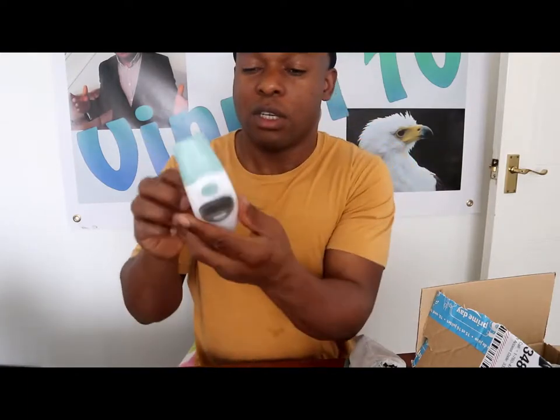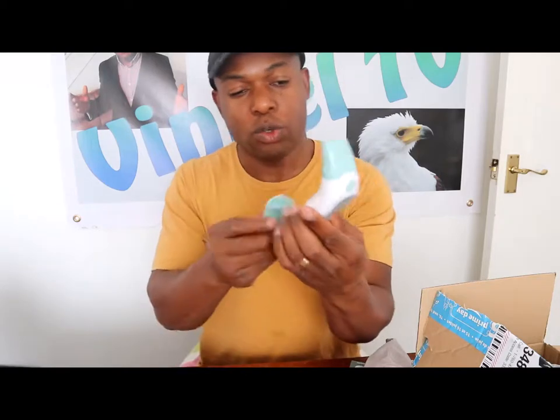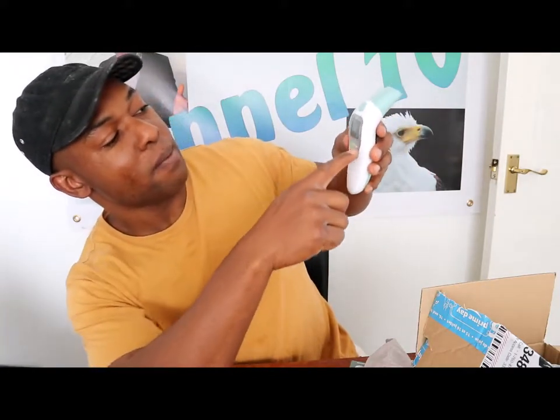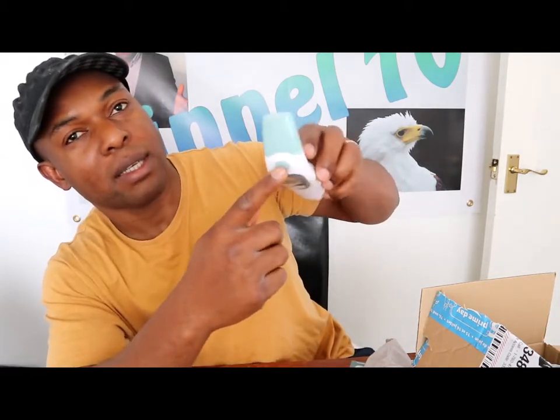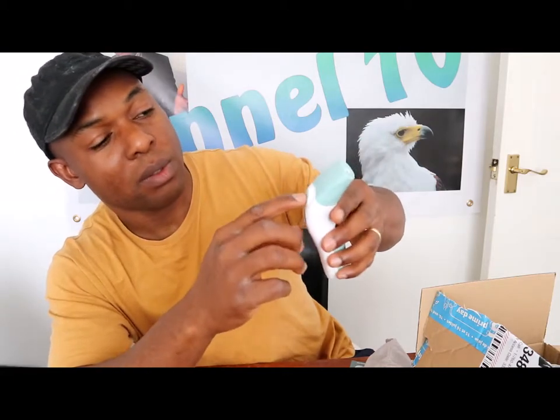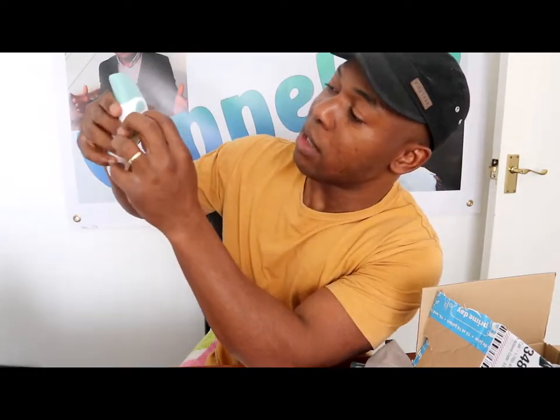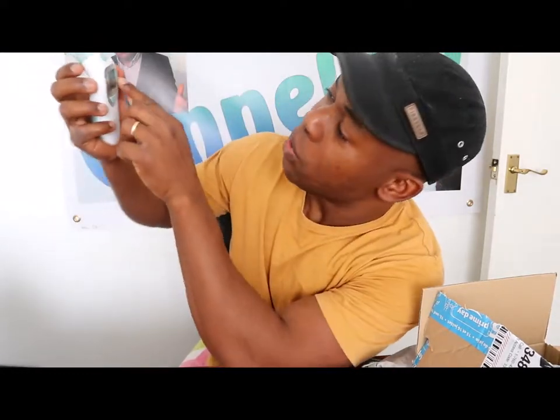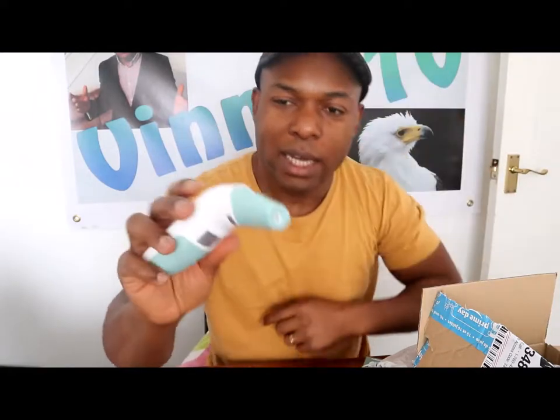Once you put the battery in, it will show you a display reading. Press the cover up and take this — this is the screen where you check the reading. The start button is here — press it and you'll see the reading. It shows 'Low' to start. Take off the plastic probe cover. It shows you a temperature of 36 degrees.